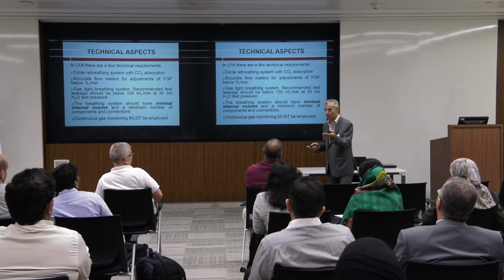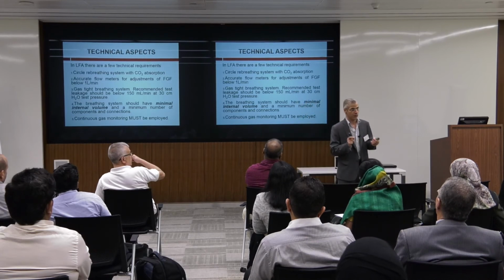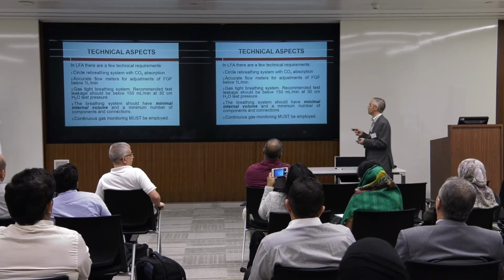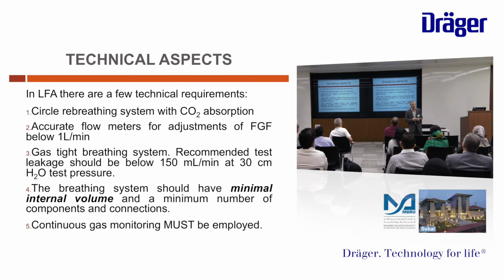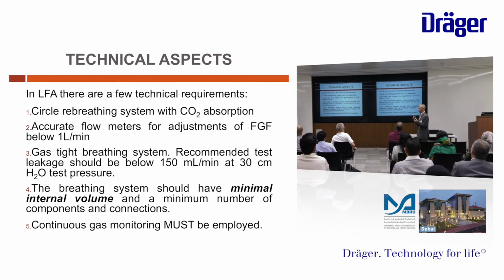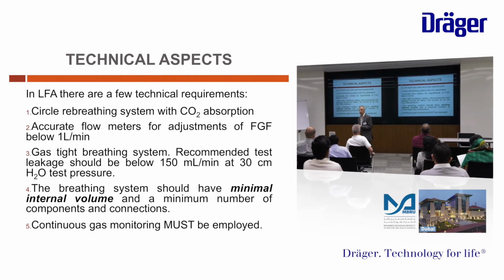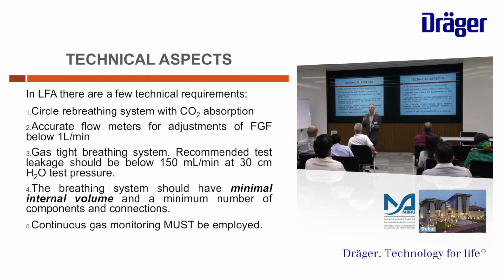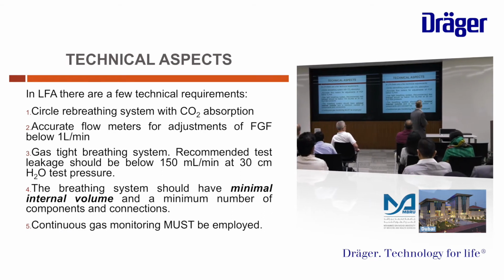As the doctor said, sometimes you are having leakage. So there are at least minimal accepted standards to perform low flow anesthesia. We should not go to low flow anesthesia if we don't have this standard. The circle breathing system with CO2 absorbers, and it should be very potent CO2 absorbers. And sometimes I noticed this with some cheap kinds of CO2 absorbers that really it will not work. And you will notice that the end tidal CO2 is rising all the time, even with 2 and 2.5 liters. So be sure that the CO2 absorber is functioning perfectly.